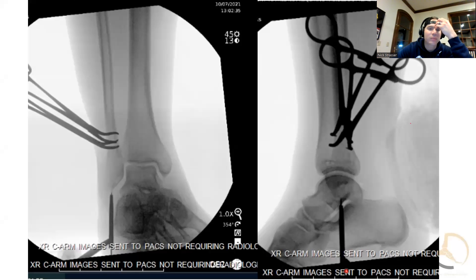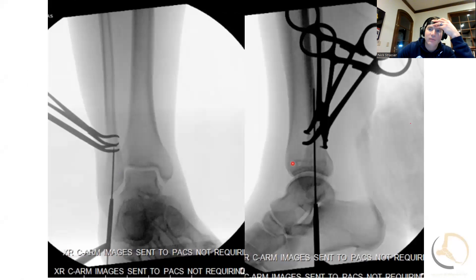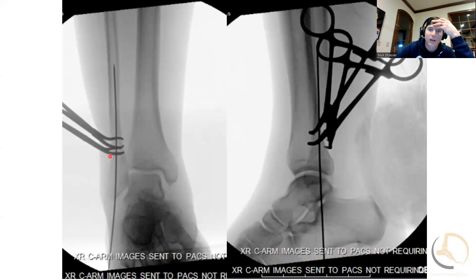Your incision is going to be a little more distal to put the intramedullary implant, trying to get inside the tip of that fibula — slightly inside — because inevitably the reamer or drill wants to push you a little more lateral and you want to really protect that lateral bone. I tried to start it just a little bit posterior, showing the starting points and then advancement of the K-wire. We tried to adjust to get a little bit more posterior, but it kept going in that spot, so we ended up accepting that and then advancing the K-wire proximal.